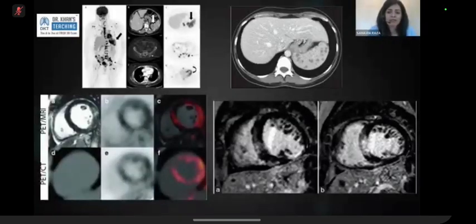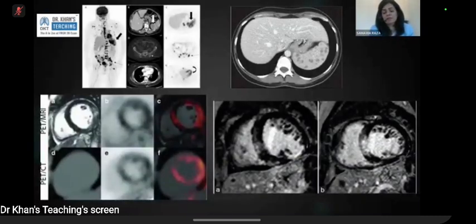And if somebody does progress a lot, or they're quite symptomatic, they can have PET scans to look for uptake and extent of disease. In terms of cardiac abnormality, what was previously done with nuclear imaging is now done with cardiac MR. So I don't expect you to be experts in cardiac MR, but in terms of exam purposes, just something to remember by: when you have infiltrative cardiomyopathy, or you have an abnormality in the heart muscle that has infiltrated the muscle with abnormal cells rather than ischemia, you have mid-wall or epicardial inflammation.